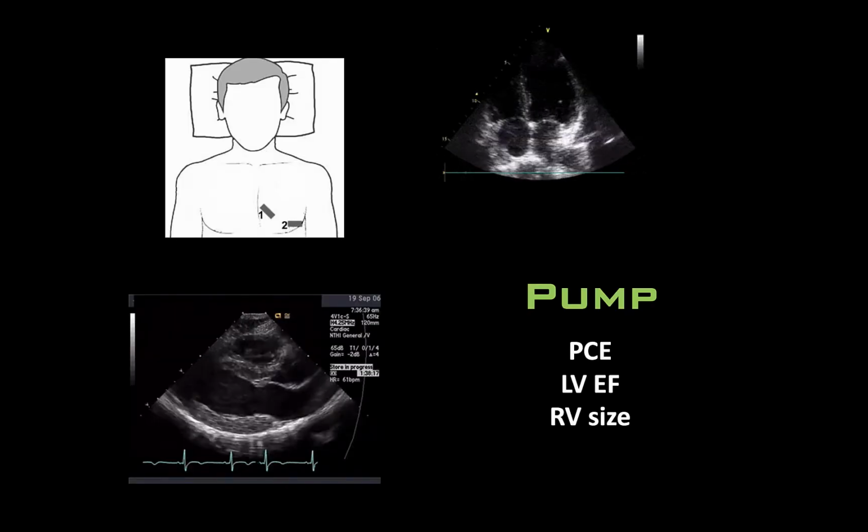For this tutorial, I will outline a more simplified mental model of the information that you're trying to acquire. I'd like you to envision hemodynamic physiology to be composed of 3 parts: the pump, or the heart, the tank, which is the fluid volume or preload returning to the right side of the heart, and then the pipes, which represents the arterial system that perfuses tissues.